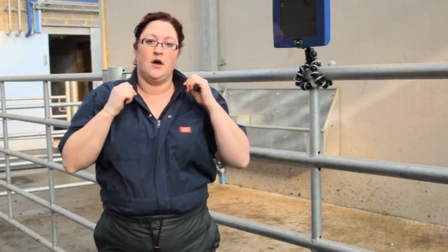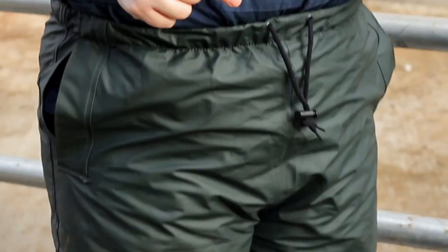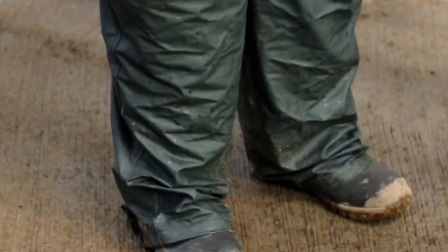Then need to make sure that we have appropriate clothing on. So in this case, I'm wearing a boiler suit or coveralls. I'm also wearing waterproof trousers, and I'm also wearing welly boots.